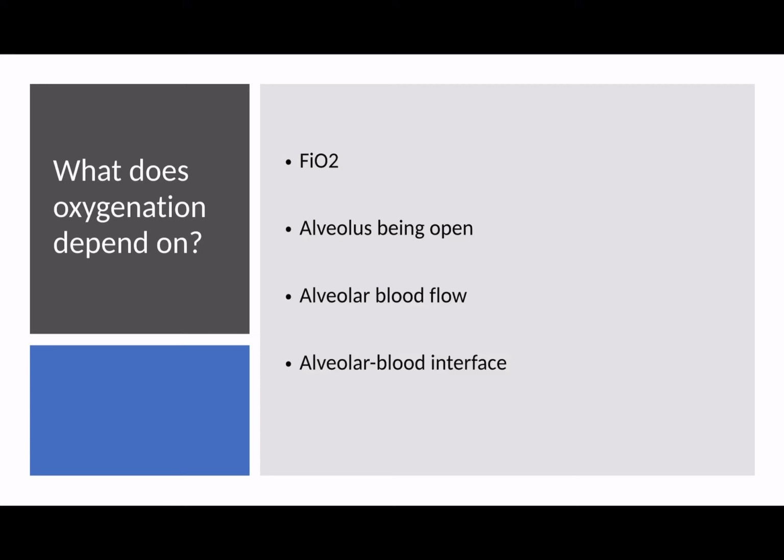Now, this can impair right ventricular filling and therefore reduce cardiac output. And therefore, even if you've improved the amount of alveoli that are opened up, if you've reduced the blood flow to the lungs, all of that good work from opening up the alveoli would have been offset by the fact that the lungs just aren't getting enough blood to them. So the patient may become progressively more hypoxic when you start someone on APRV inappropriately.